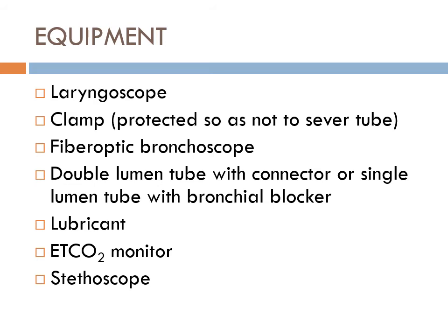So there's different ways to ask this. Are you still talking about when you're operating on the right lung? Yep. So when you're operating on the right lung, you're going to occlude the right side with the bronchial blocker. Okay. And then the left side. If you're going to operate on the left lung, you're going to put the bronchial blocker on the left side.